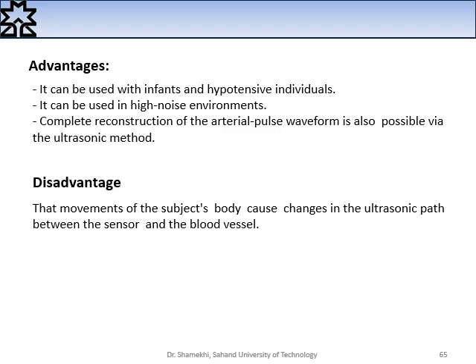Therefore, we should fix the body of the patient and we should fix the structure of our device to focus on that vessel we want to record.